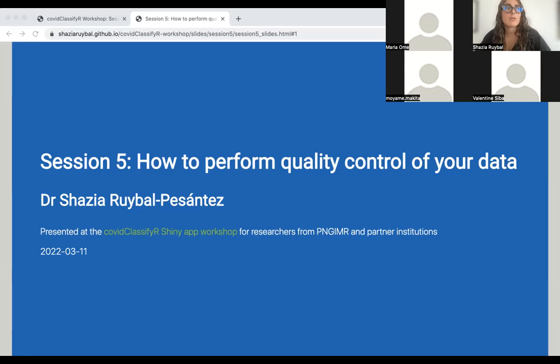So maybe I'll jump in. Let's use that example of having half of a plate condition 1 and half of a plate condition 2. The way I would suggest you approach it using this app is, everything that controls how the app interprets your data is the plate layout. So I would suggest having 2 plate layouts, even though it's actually the same raw data and technically the same Luminex run. It's kind of like 2 separate runs. So do a plate layout for the first half, ignore the rest, and process that.